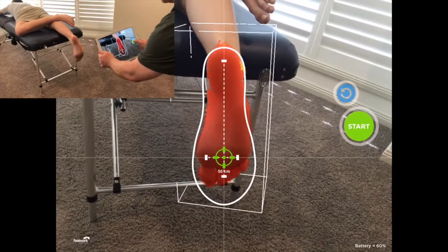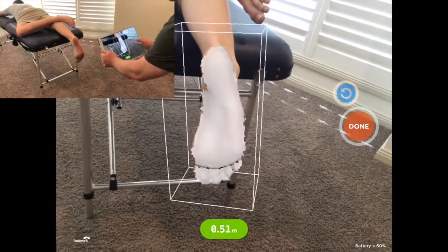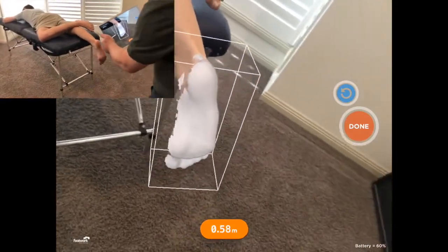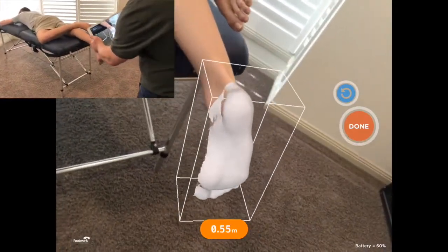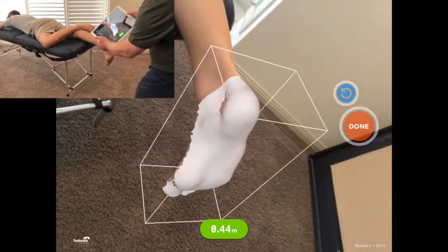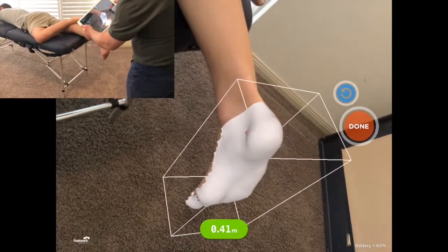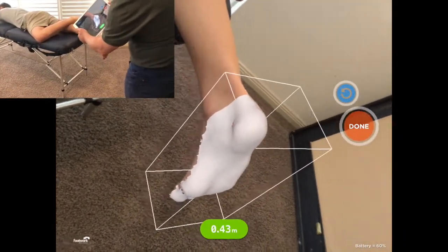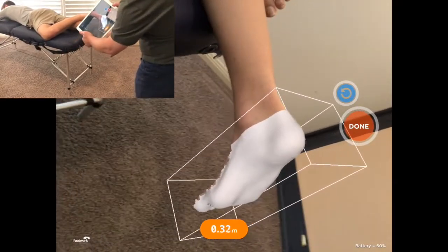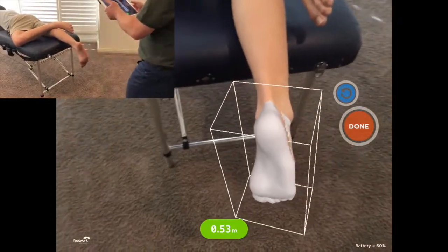As you can see from the video, the bounding box or scanning area is much smaller than you would have seen previously. This vastly increases the accuracy of the scan — so much so that when compared to the Delcam scanner, there's about 0.2 of a millimeter difference, comparable with the iCube E500, which is probably the most accurate scanner on the market to date.